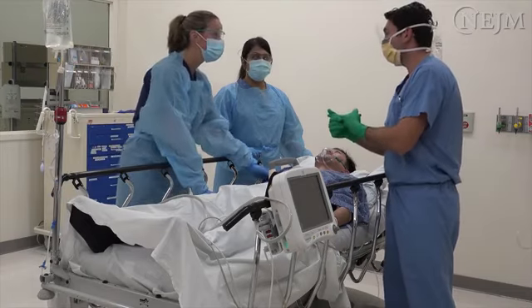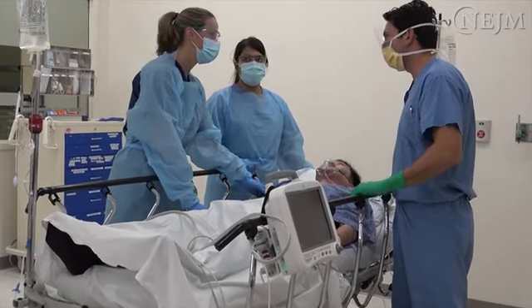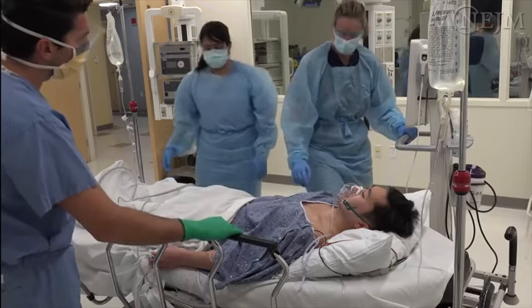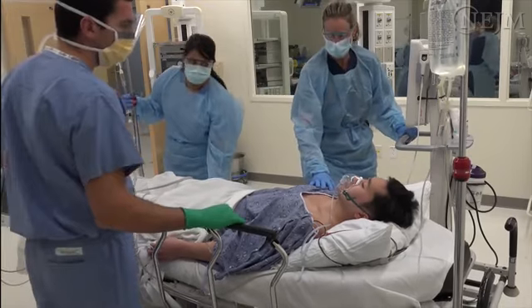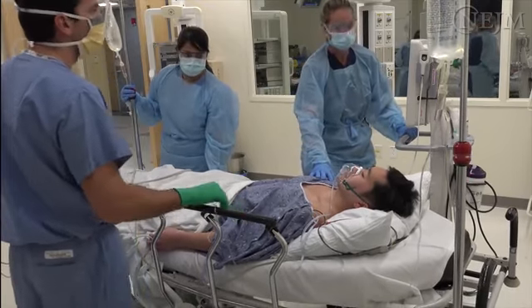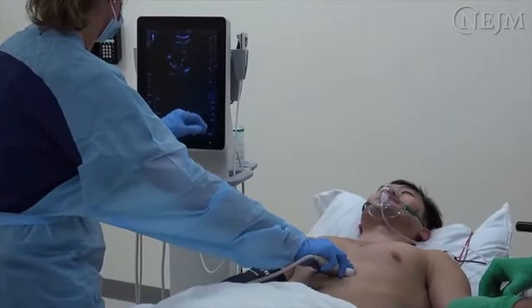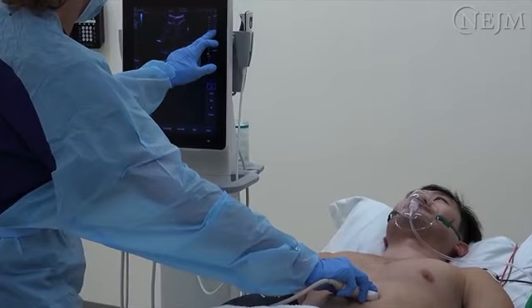Examining patients with the use of EFAST, or extended focus assessment with sonography for trauma, requires planning, preparation, and practice. Clear institutional guidelines can maximize the efficiency and accuracy of EFAST examinations and help to provide the best possible care for patients with acute trauma.